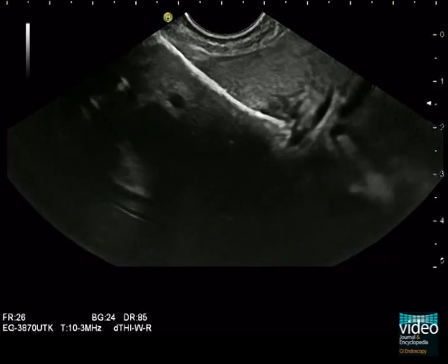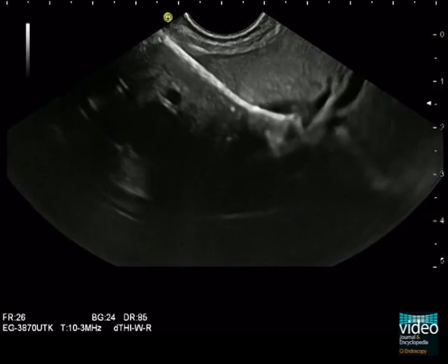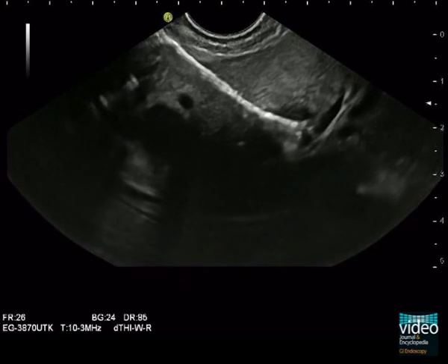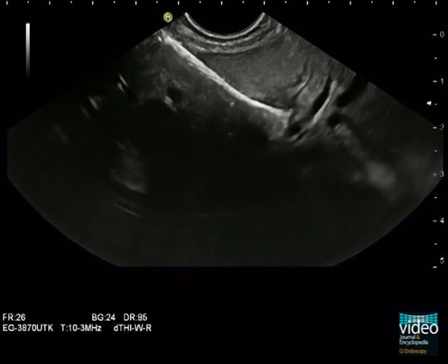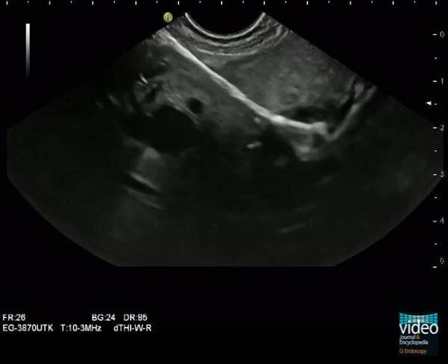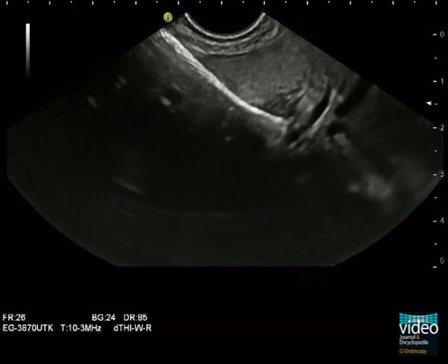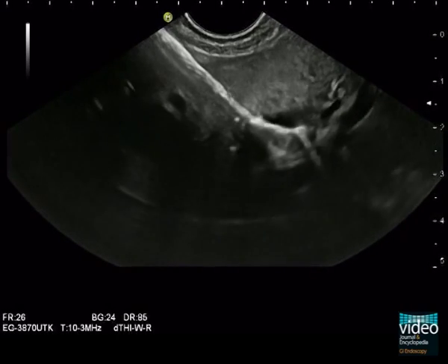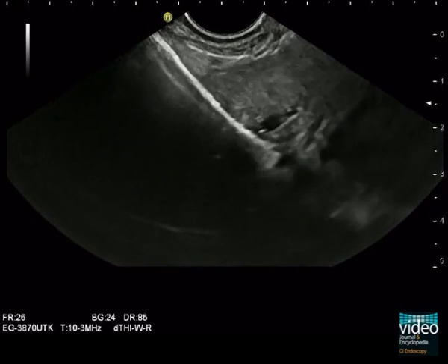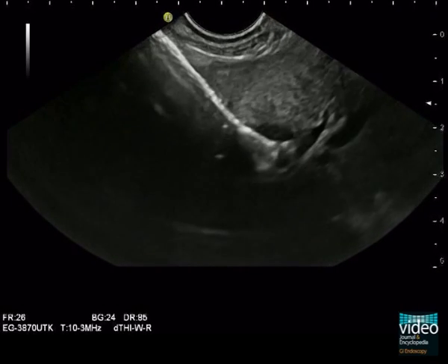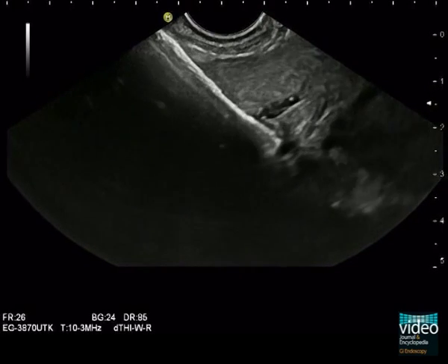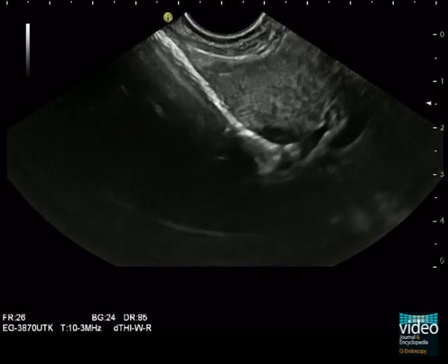At this moment, it is essential to hold a close position to the gastric wall, in particular if the releasing stent reaches the space between the gastric wall and liver surface, to prevent stent dislocation into the abdominal cavity. It is necessary to draw back the delivery system from time to time, watching that the distal stent end is held at the correct position, in particular the intrahepatic stent end already placed within the bile duct.